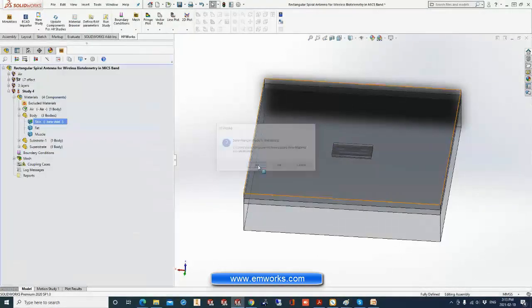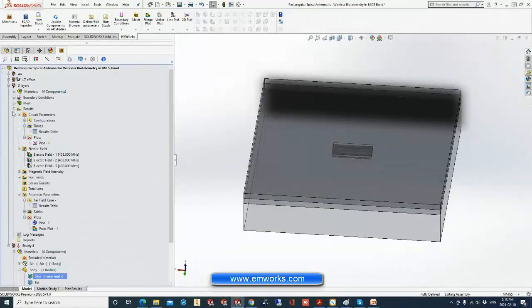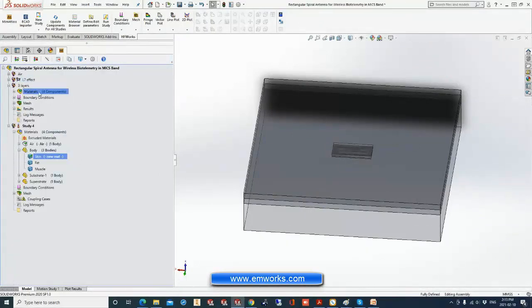Okay, so if you have, for example, any existing study, we can drag and drop the material from the previous study, for example from here to here, just to copy everything. See here.